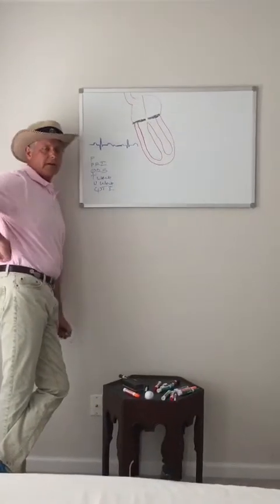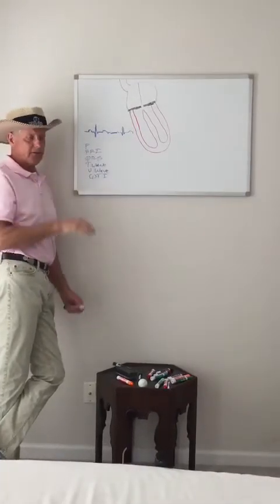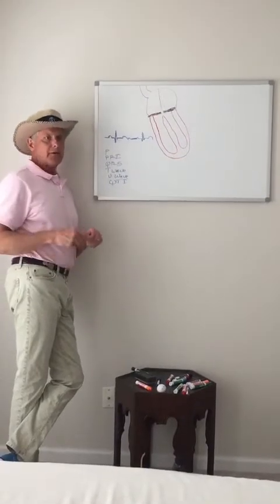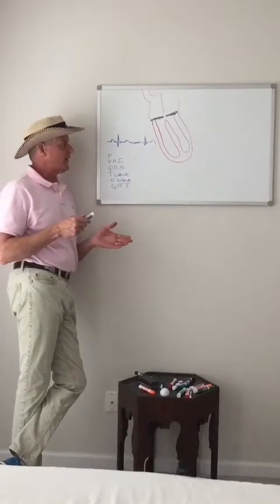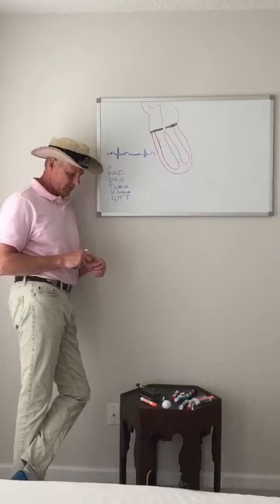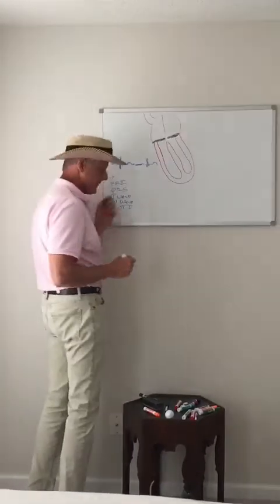All right, so we know how the EKG machine works. Now we're going to relate it to an actual heart, not just a piece of heart muscle. And I don't want to offend anybody. We're going to start with the normal EKG, the P waves, QRS complex, T waves. I'll get back to that in a second. We have to have a good understanding of normal depolarization and the anatomy associated with that.